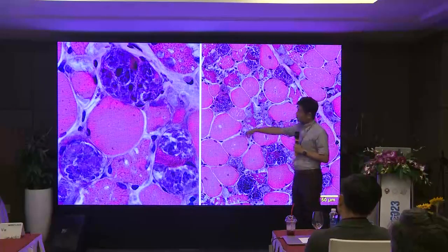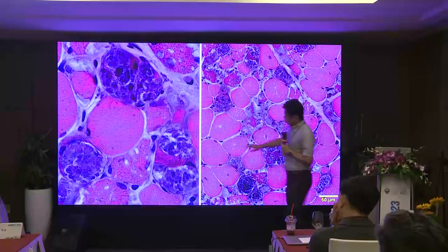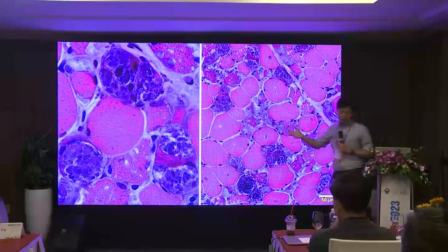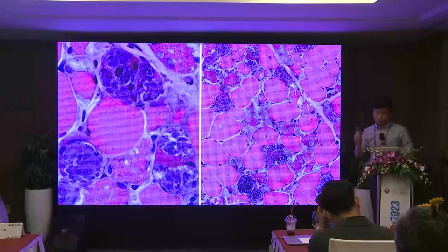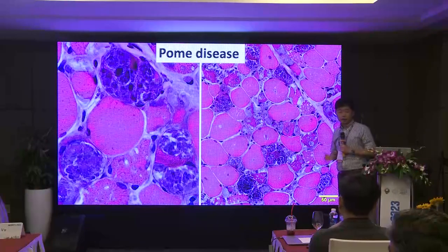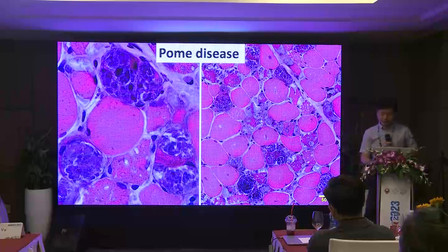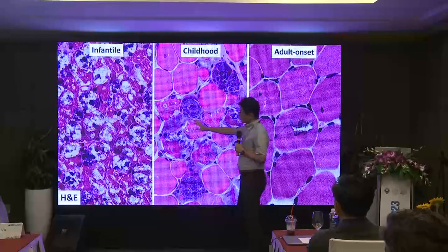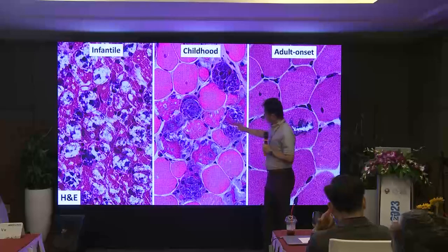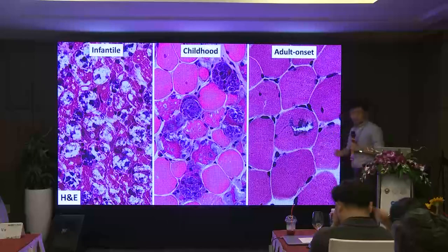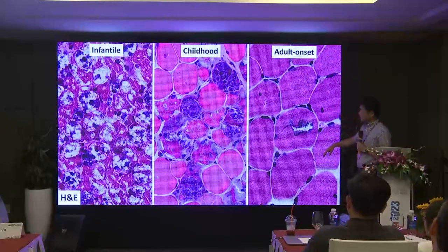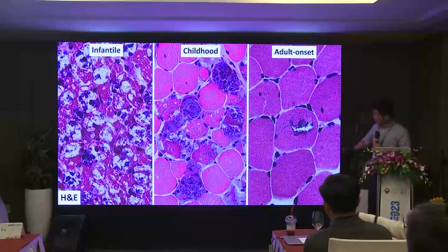In terms of myofibers, you sometimes see this type of unique vacuoles. In one fiber you can see very huge vacuoles with something amorphous basophilic inside. This pattern can be seen in only one disease — it is very characteristic. This is Pompe disease, which is important because it is treatable — there is enzyme replacement therapy available. In younger infantile-onset cases, almost all fibers have vacuoles. In childhood onset, only selective fibers are affected. In rare adult-onset cases it is very difficult to diagnose because not all fibers have vacuoles.